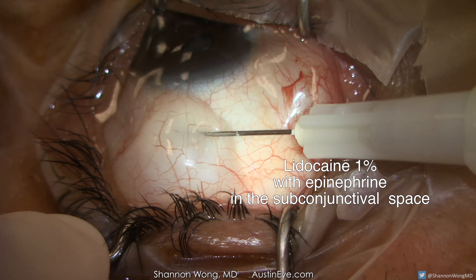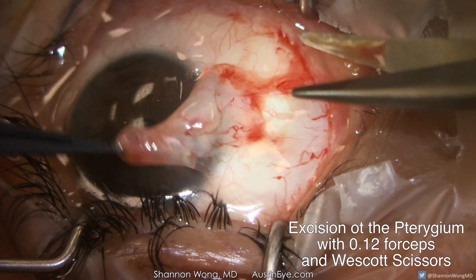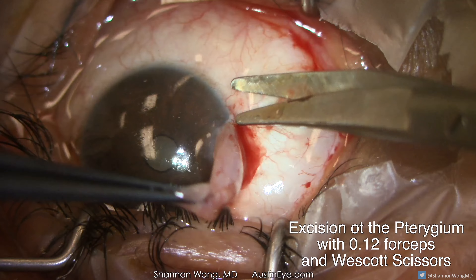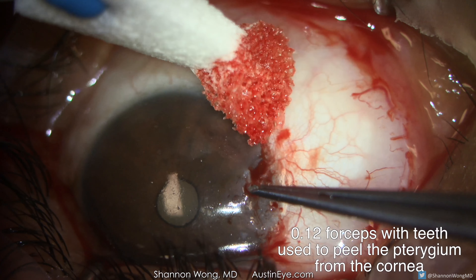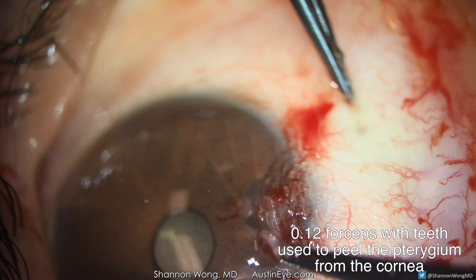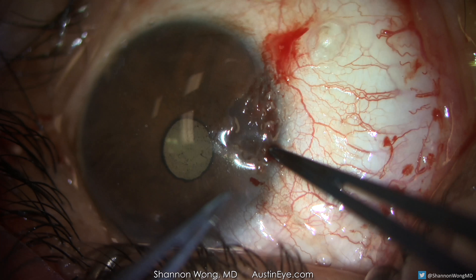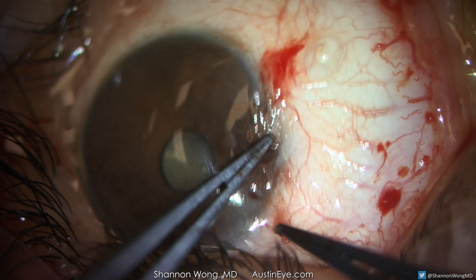The first surgical step is to remove the pterygium. We lift the conjunctiva about five to six millimeters from the limbus, then incise the conjunctiva. We are careful to avoid incising the medial rectus muscle that is in this area. Then we peel the head of the pterygium from the cornea. Any pterygium remnants on the cornea are then peeled away with 0.12 forceps with teeth.